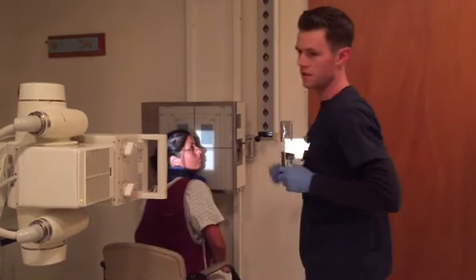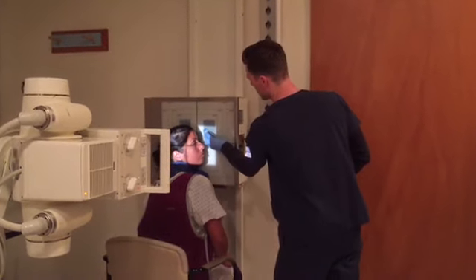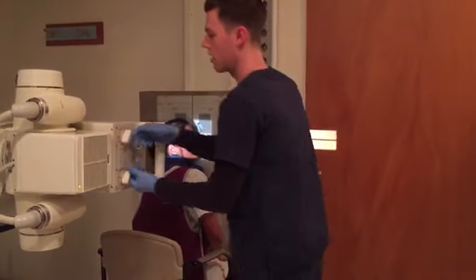Perfect. So this one, since her left side is the side that's bothering her, it's up against the board. I'm going to place my left marker. Collimate down.